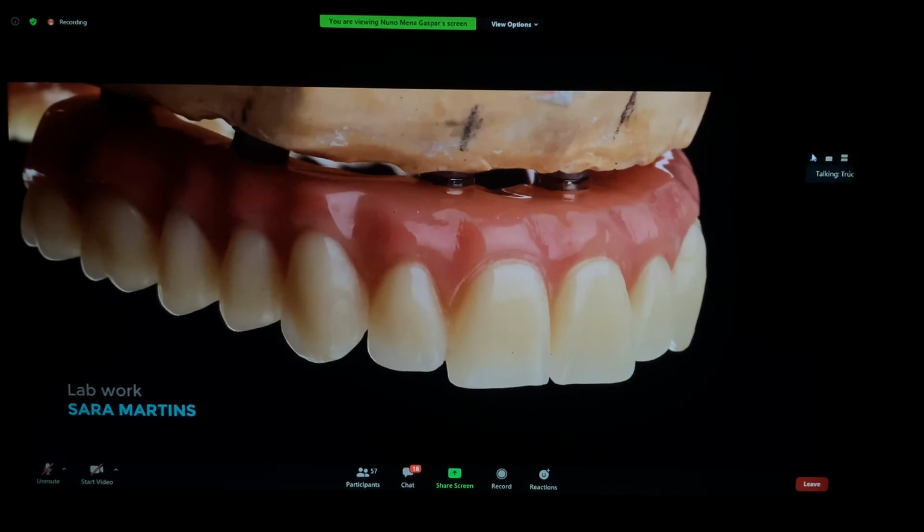And the other thing is, like I said, bone reduction defines what prosthetic space you have. If you have a simple defect, like you only miss your teeth, you can do pontics, no gum.